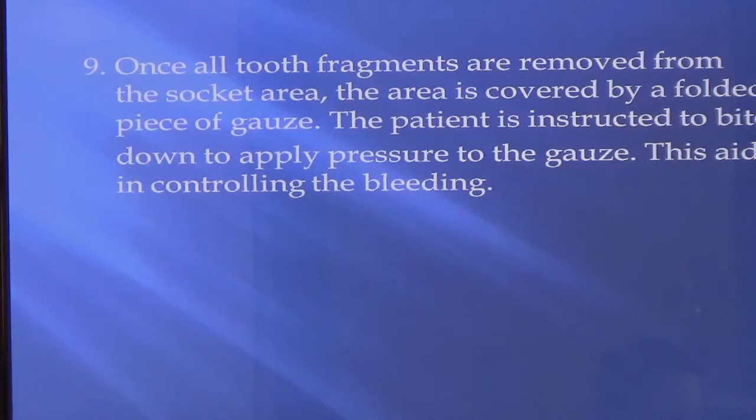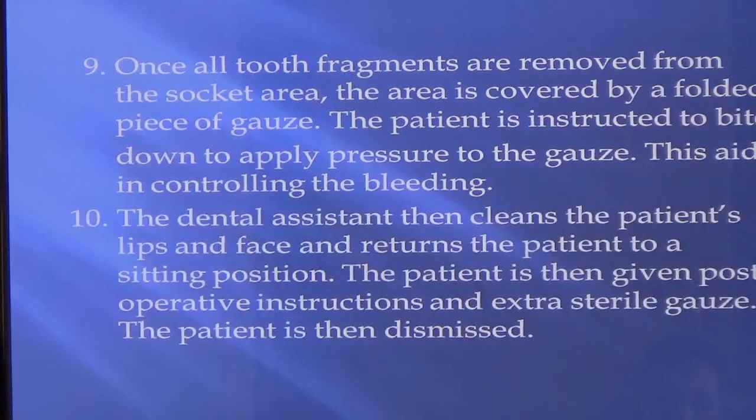At that point, we need to decide whether we put gel foam, which is like a clotting foam that helps the patient stop bleeding, and we may suture it to get it to stop bleeding. But we can't let the patient get out of the chair if they're still bleeding. They're gonna get in the car and change their gauze and just keep bleeding. So that's the main thing, we make sure that they stop hemorrhaging before we let them out.